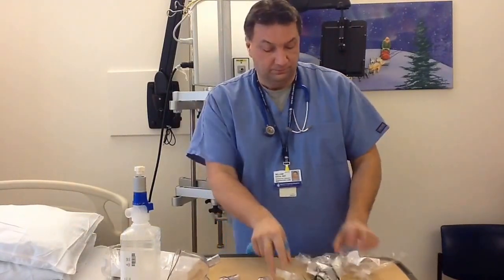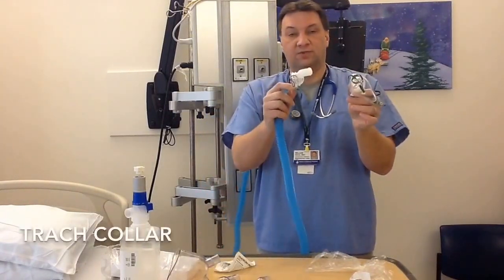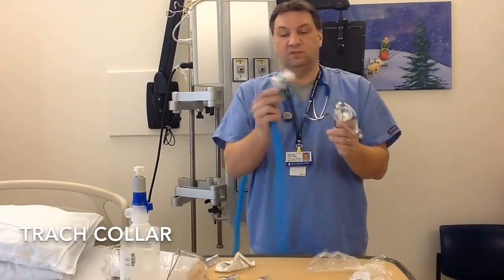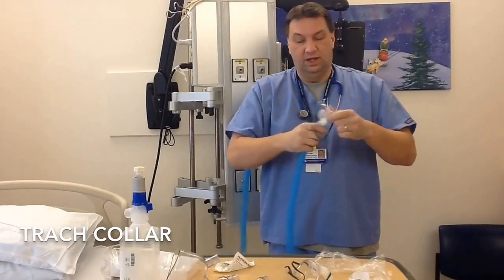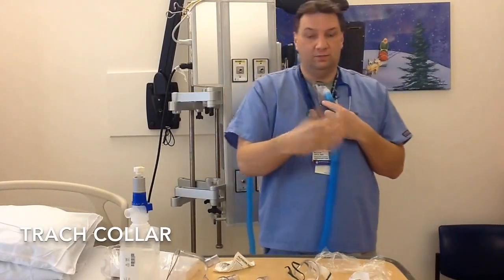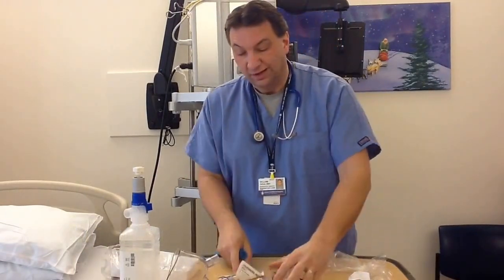A couple other devices that we have are the actual trach collars. We have two different sizes, one for the adult and larger pediatric patients, and one for the infants. And again, this connects to the blue hose, everything connects to the blue hose, and it just sits right over the trach, and then we're able to, again, humidify and provide oxygen directly to the trach. So we have many options here that we can use.